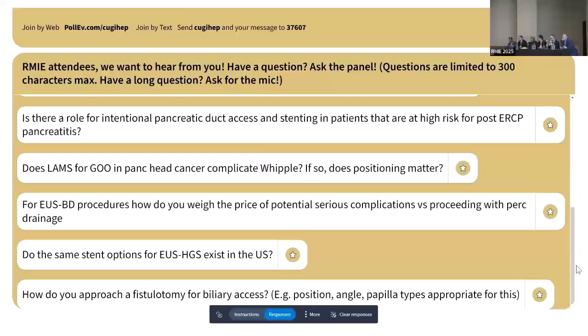Having said that, there are fundamental differences. In a difficult case, for example lithotripsy or difficult stricture manipulations, you have a lot more pushability using the percutaneous PTBD route compared to the EUS route. So for cases that are really complicated, or where I'm anticipating more than one technical difficulty, I'd rather go the PTBD route, especially where pushability becomes a significant factor.